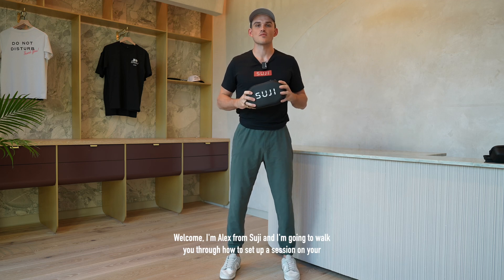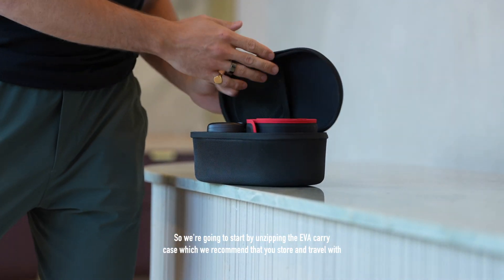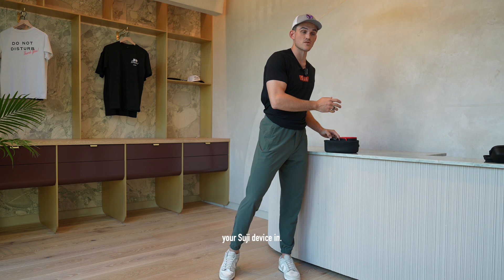Welcome. I'm Alex from Suji and I'm going to walk you through how to set up a session on your Generation 2 device. We're going to start by unzipping the EVA carry case, which we recommend that you store and travel with your Suji device in.